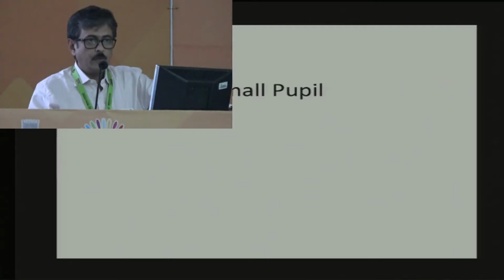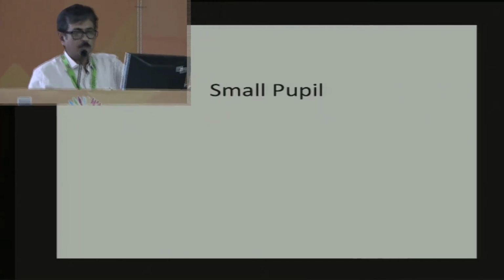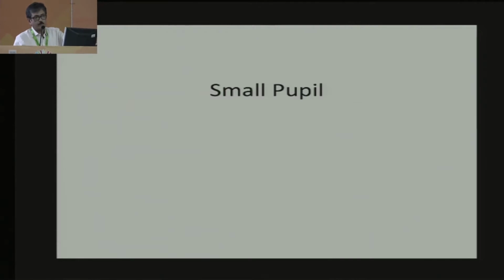The small pupil which needs treatment. Which small pupil needs treatment before phacoemulsification? How small? This is the main important issue.